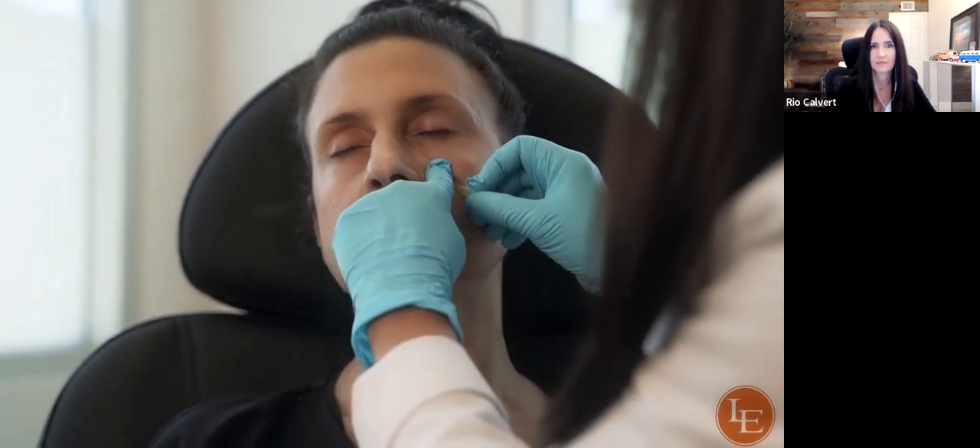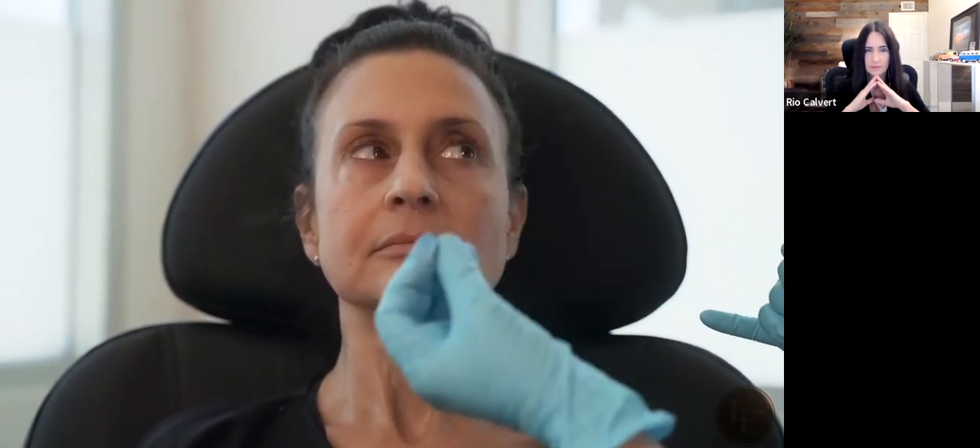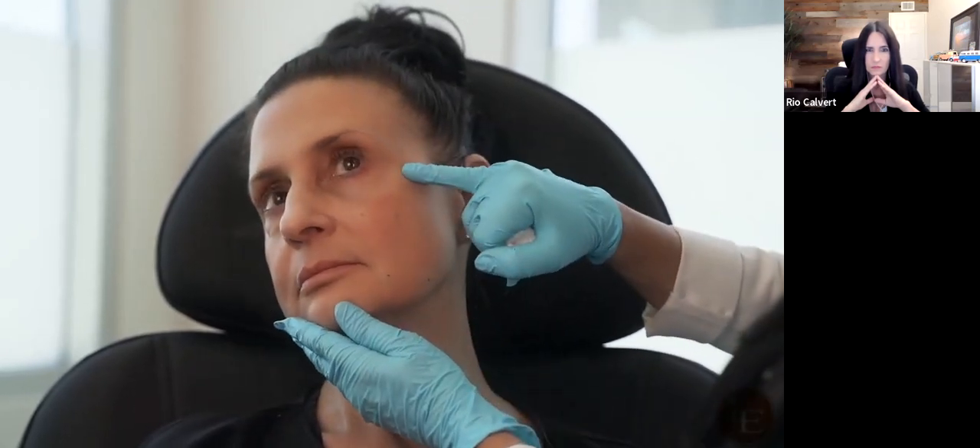Just right underneath the skin into the tear trough. Ensure the cannula is pushed forward, press down, turn to engage and get it off the cannula. The body will absorb it over time; results get better and better — not one and done. You can also use twisted smooth threads for a little more volume in the under eye area. You can also make an entry point at the lateral canthus and stream threads in that direction. With one or two entry points, the entire tear trough area can be filled in.